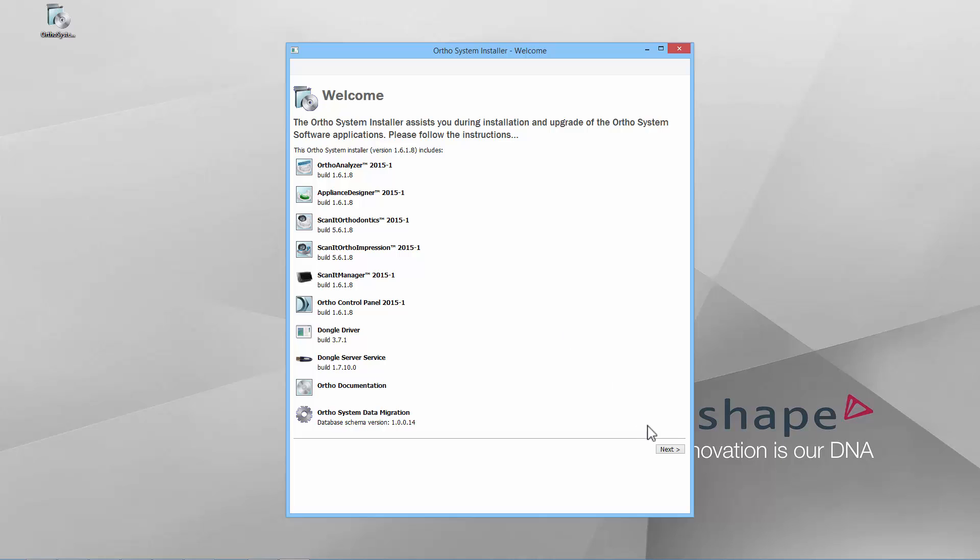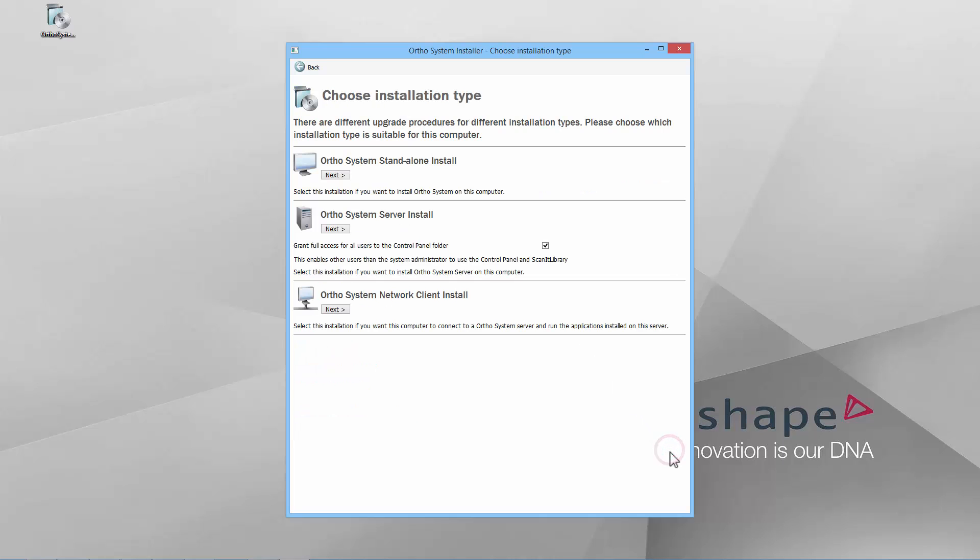Click Next to proceed. In the next window, you are able to choose the installation type by clicking the corresponding Next button. There are three types of OrthoSystem installations.